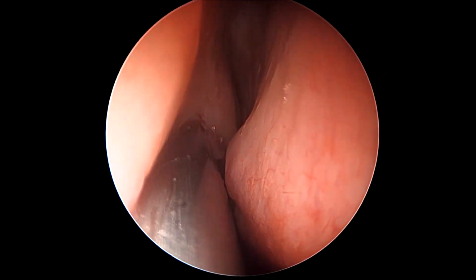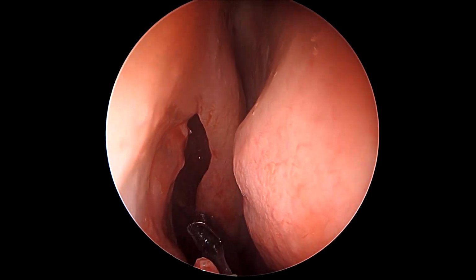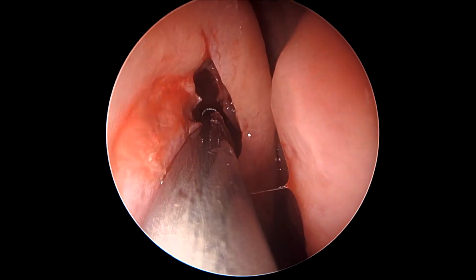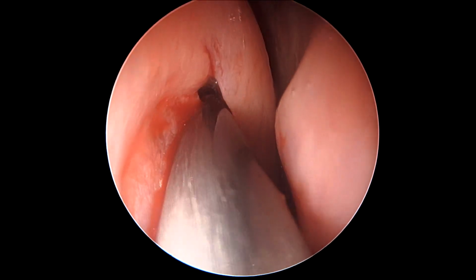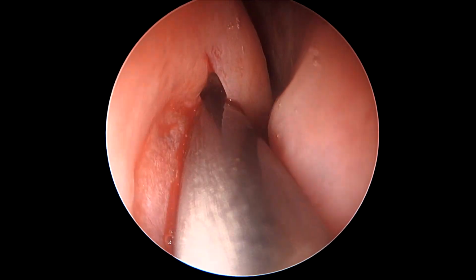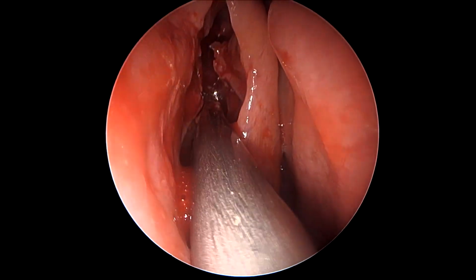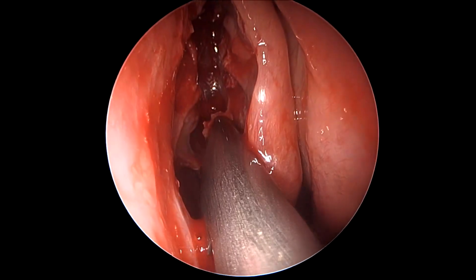So once again, we resort to removing some portion of the anterior wall of the agger nasi, towards the attachment of the middle turbinate, the axilla of it, to create a better viewing angle inside the frontal recess region. Otherwise, this step would require possibly angled scopes like 70-degree scopes to be able to visualize.